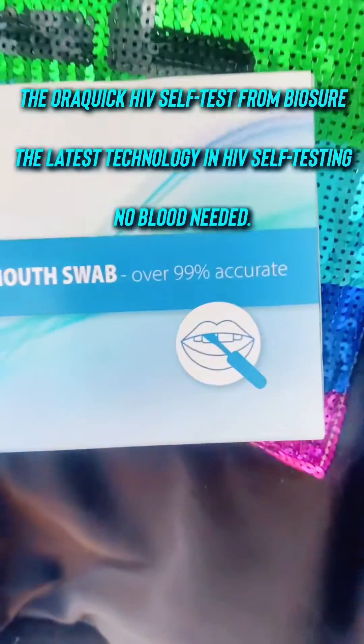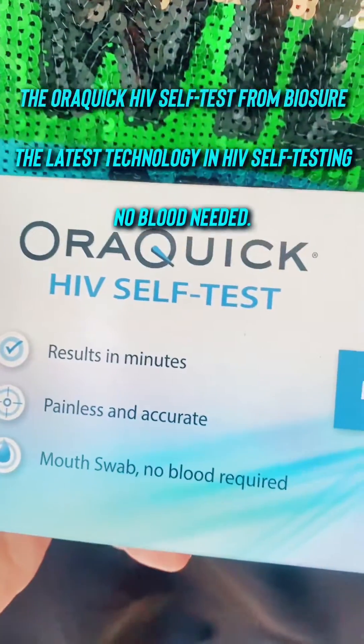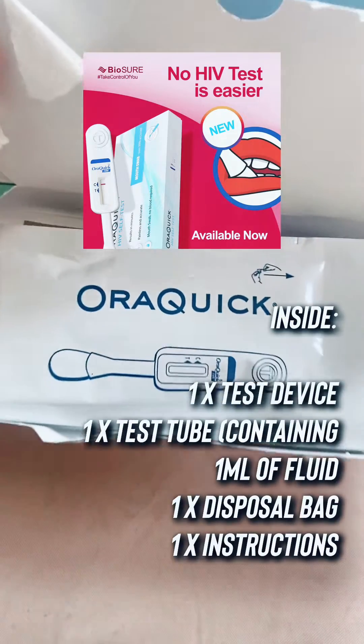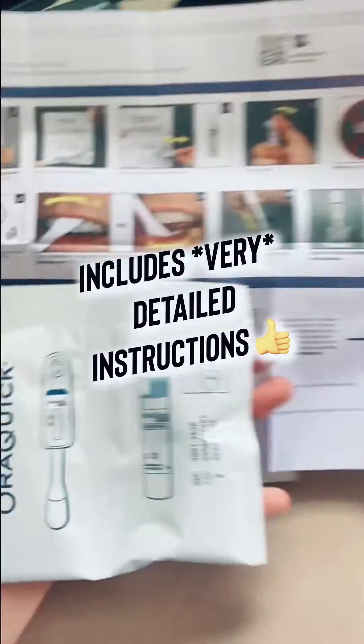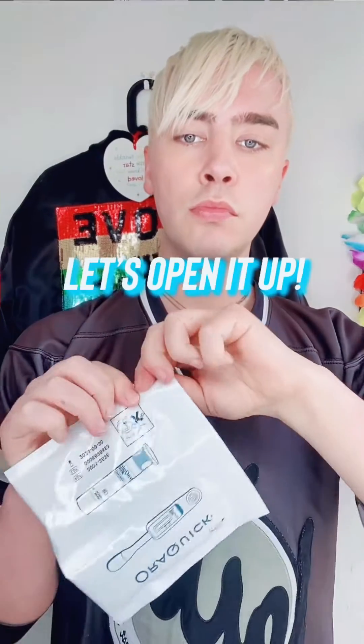This is the OraQuick HIV Self Test, which has been brought to you by BioSure and is available at HIVSelfTest.co.uk. This test is ideal for those of you that don't like needles, because there is no blood needed.